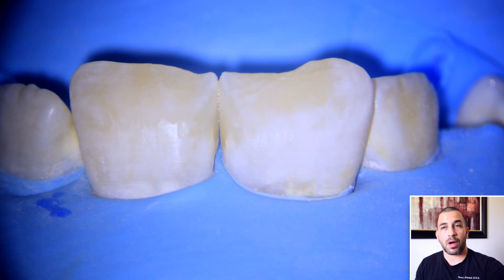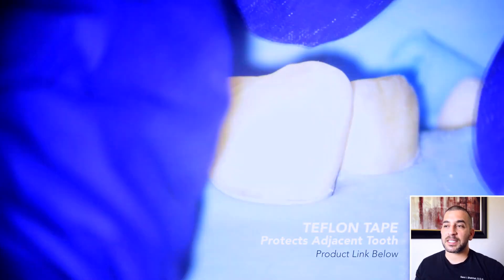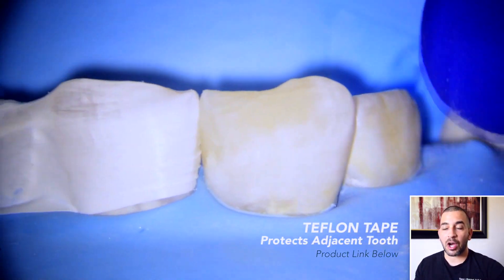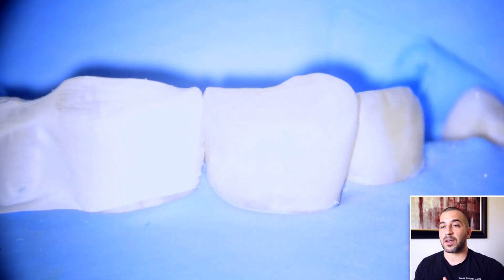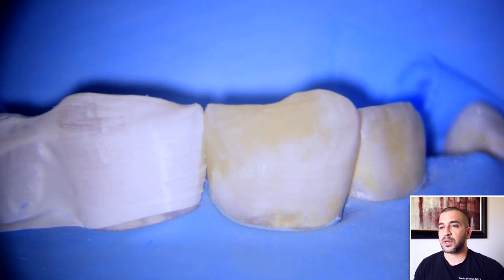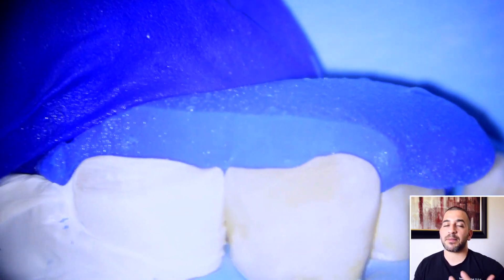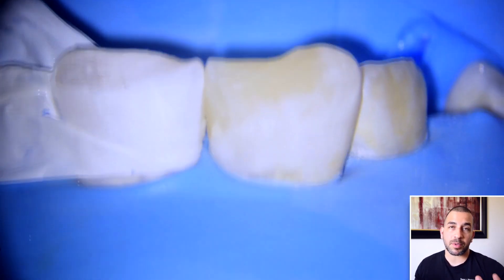Next I'm applying a Teflon tape in between the teeth that I'm working on. The Teflon tape helps protect the adjacent tooth from chemicals like phosphoric acid etchant, which if left on the adjacent tooth can cause post-operative sensitivity. So it's just a means to protect the adjacent tooth. Also you won't have any bonding getting in between the teeth, which can make it a little bit more messy towards the cleanup process at the end of the procedure.